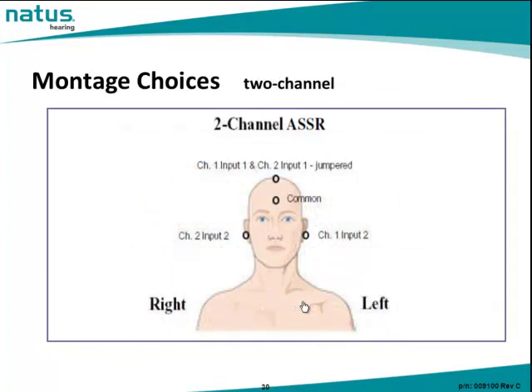There's also a 2-channel option for montage, and this is the same 2-channel ABR montage that you would use for an ABR evaluation.